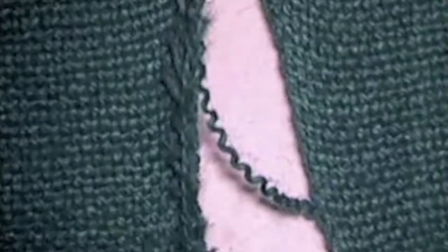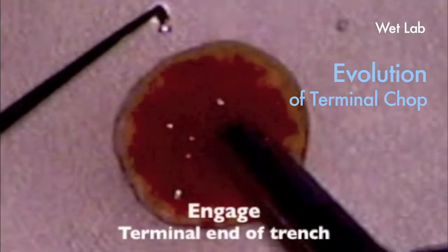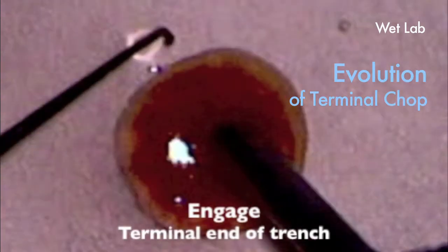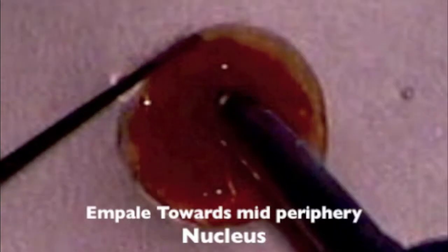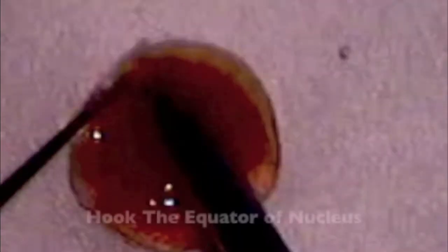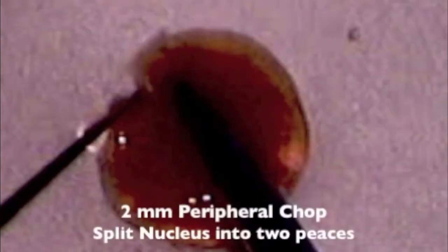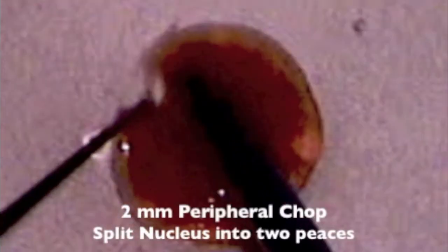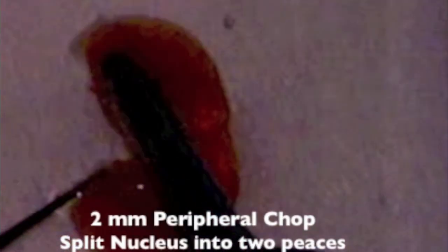into two complete segments. The concept of the terminal chop technique evolved with extensive clinical experiments performed on the extracted hard nucleus procured from extracapsular cataract surgery in our clinical setup. Division of the nucleus was only possible after holding the equator of the nucleus with the phaco probe and blunt chopper adjacent to the initial nick.